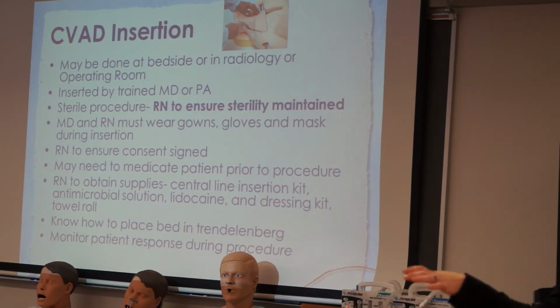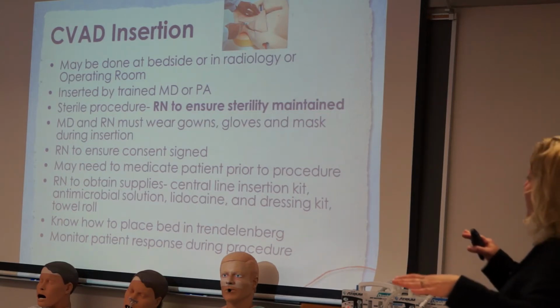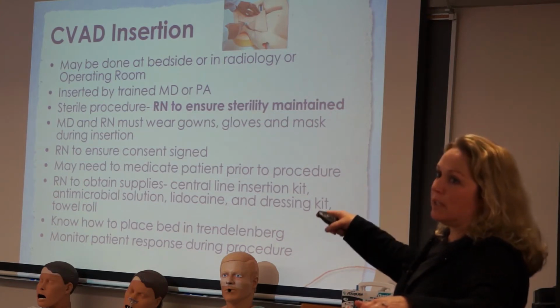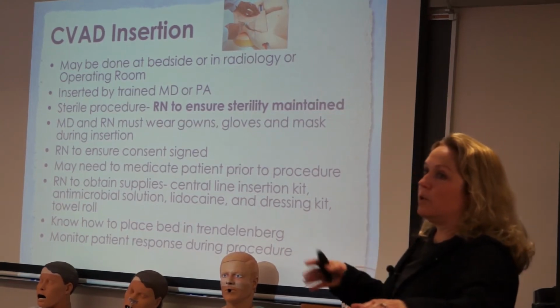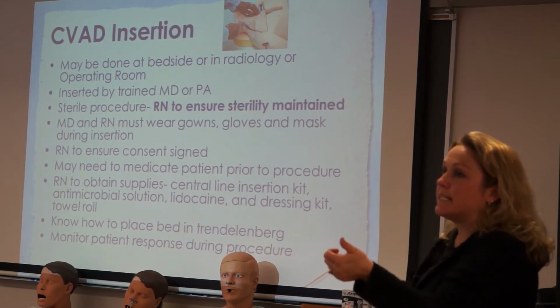So what you may be asked, if your physician is wanting to put a central line in at bedside, or if you're working in the ED or ICU at some point and you need to have one of these placed, is you're going to need a central line insertion kit. And in those kits, usually everything comes that you need. But if they don't have everything, find out what you have in that kit, because you may need to go get sterile gloves. And the doctors usually will tell you, hey, I wear a glove size 8, or I wear a glove size 7.5, or something like that. So ask the doctor what the glove size is that they need.